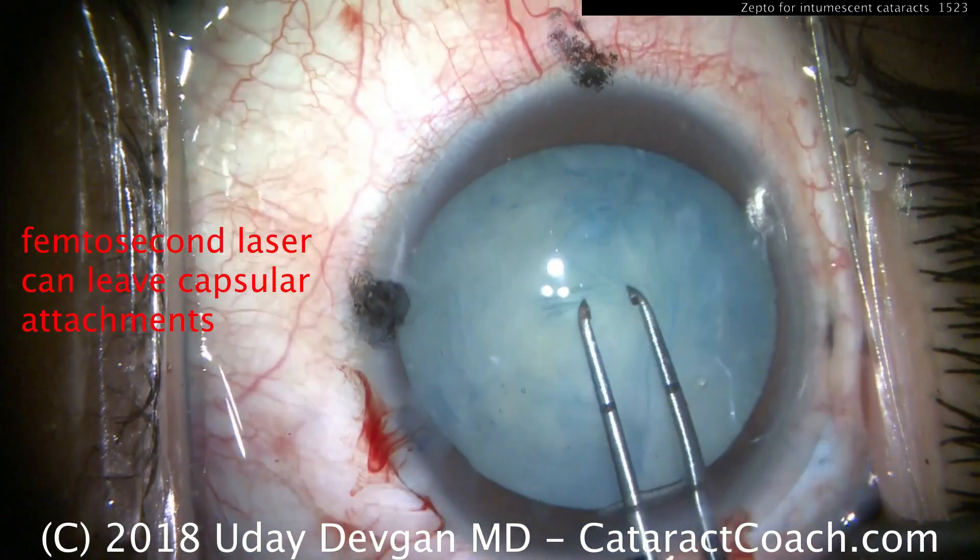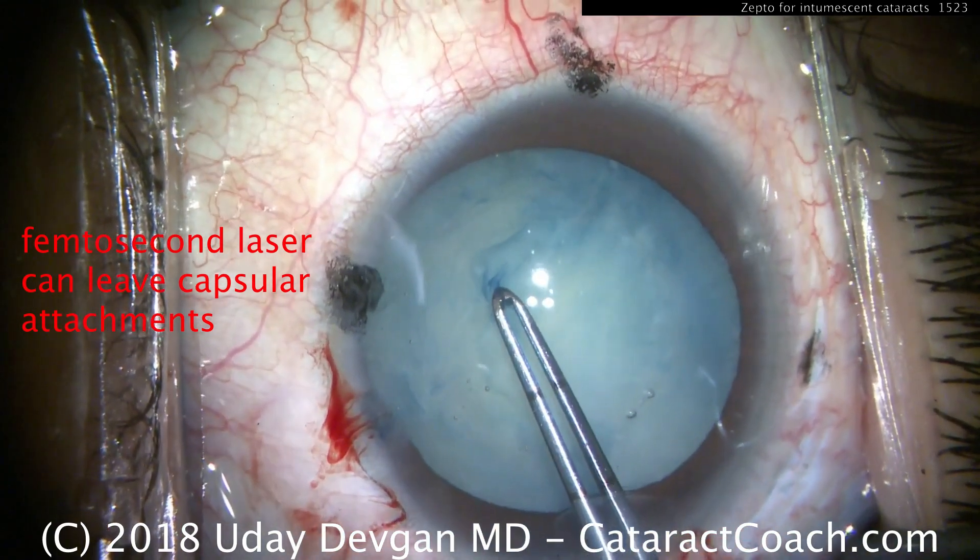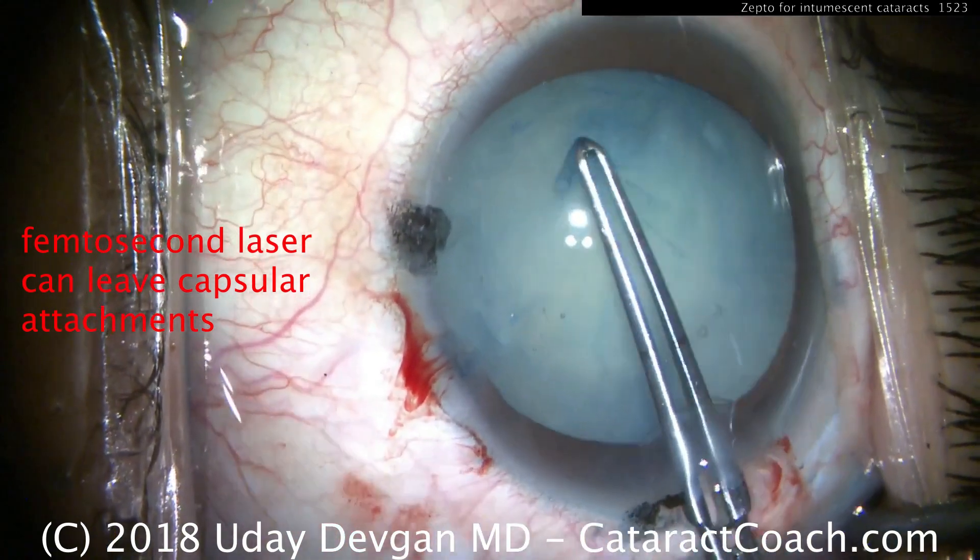You might ask, what about a femtosecond laser? Well, look at this case. A femtosecond laser can leave capsular attachments — it's not fast enough.